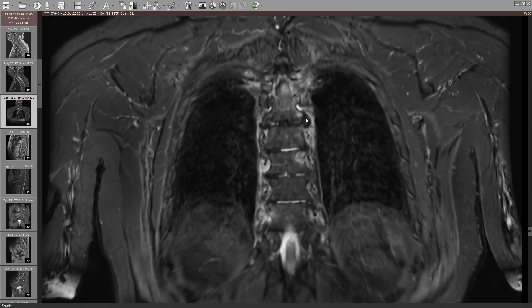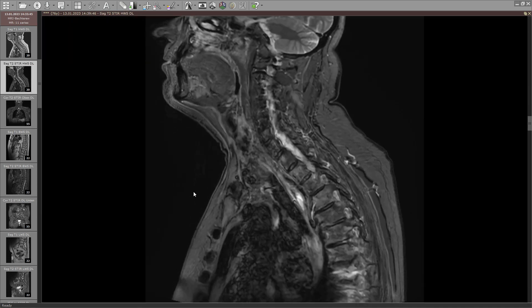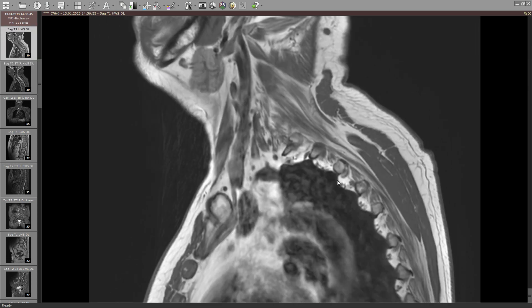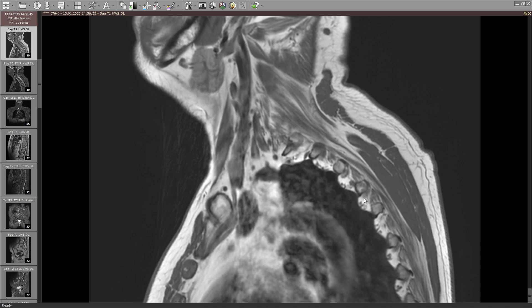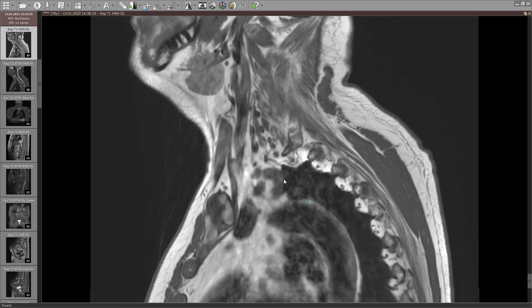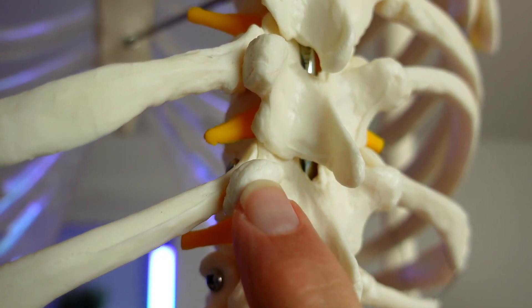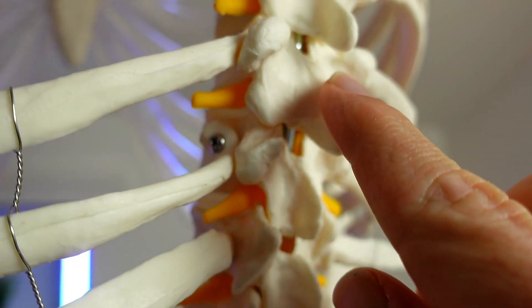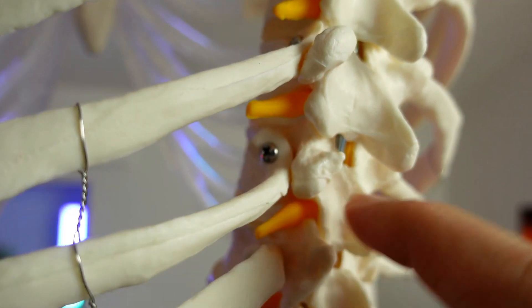This is a typical finding for these kinds of situations and we can also see this on the other side as well. We would likely also see some inflammation at the costotransverse joints. This is where we have the transverse processes and then the ribs going over them — they are even more lateral than the costovertebral joints.